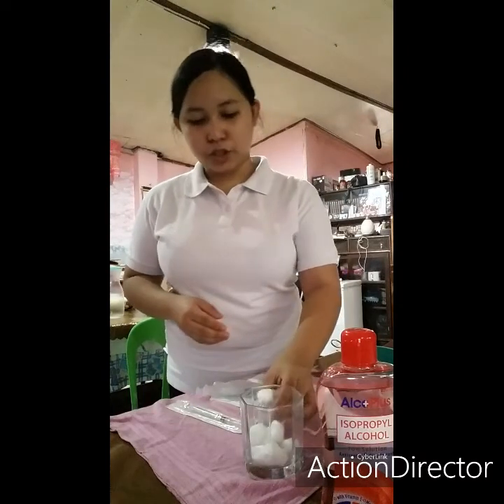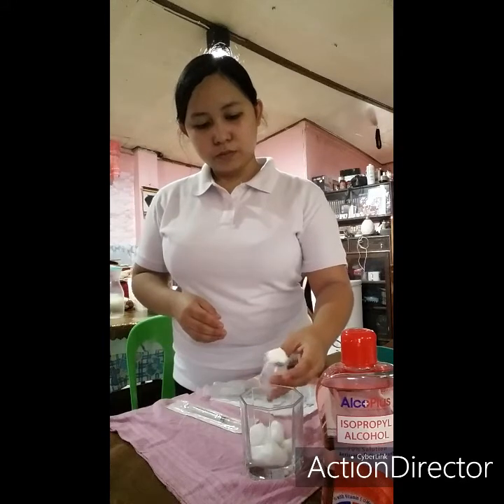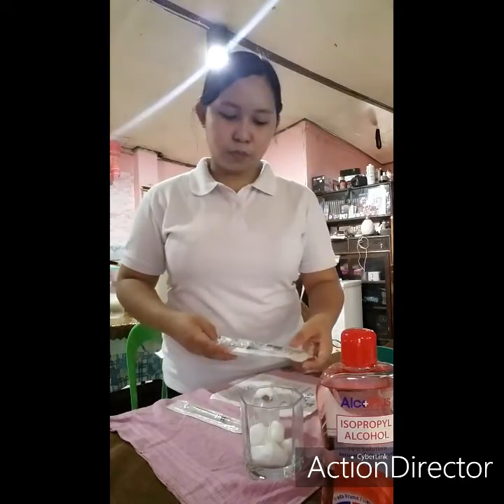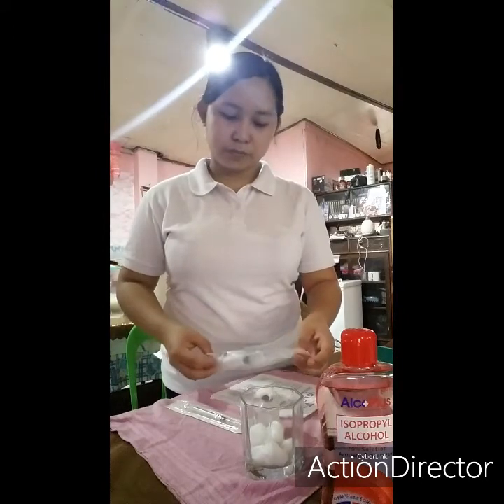Then, check the expiration of the medication and the expiration date of the syringe that we use for this injection.